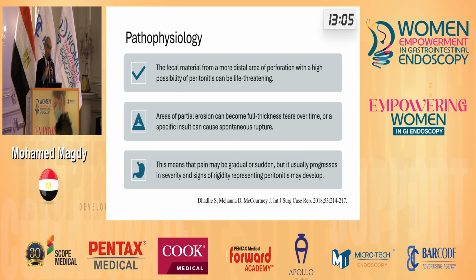We have a higher risk of perforation. Some of these perforations may be intended in some procedures, like full thickness resection, while others are accepted side effects in ESD, EMR, and sometimes other procedures.